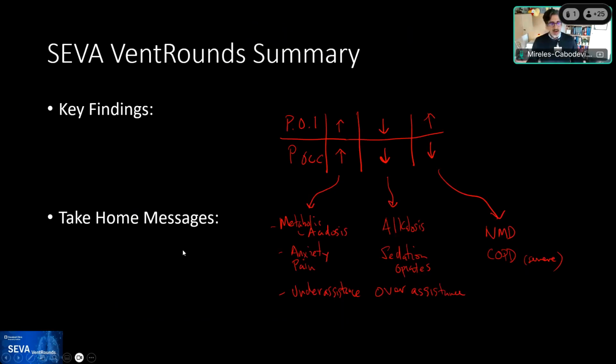I think that this is a great way to finish. This is a key set of measurements to do. We recognize today early trigger. We recognize how you choose this for the goals. What did you learn with this? What do you want the team to take home, Jorge? Did you learn something from this case? What do you want people to take home?